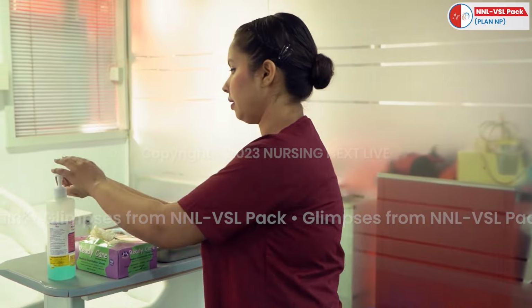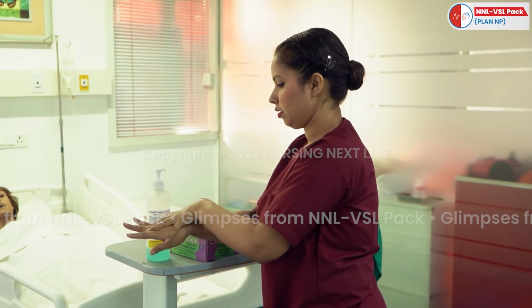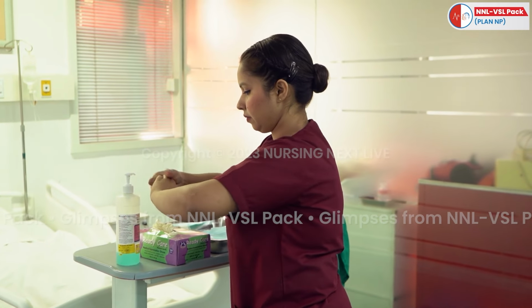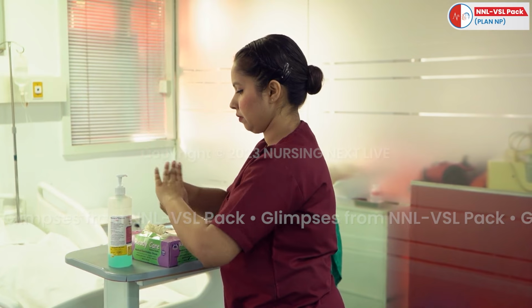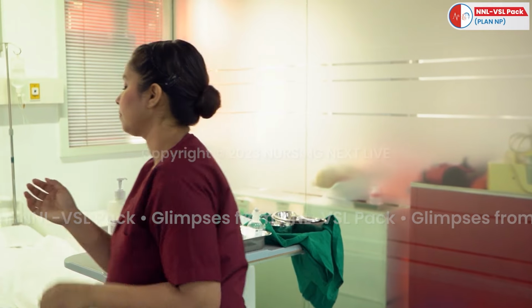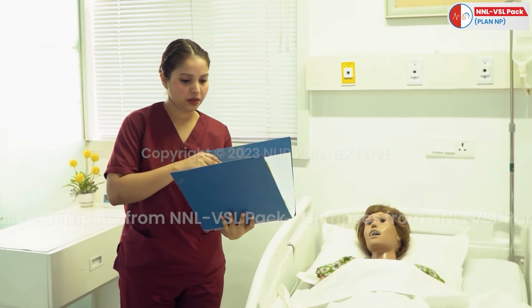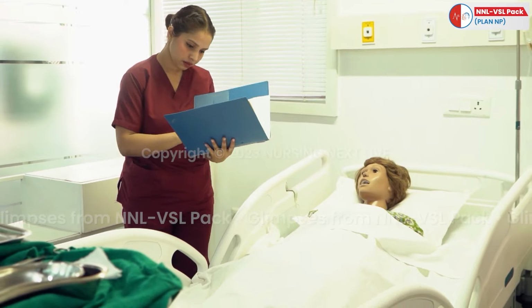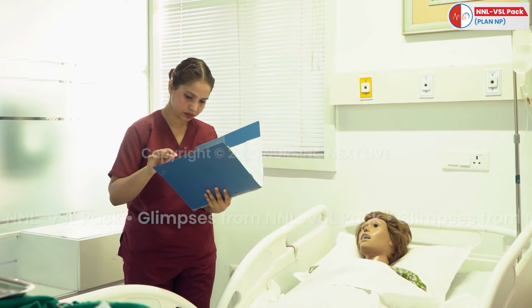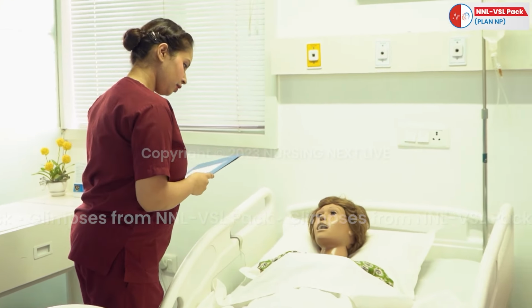Hand washing. Document on the CAUTI bundle checklist with your signature and report any findings to senior staff. Okay, ma'am, so I'm done with your catheter care. You can take rest.